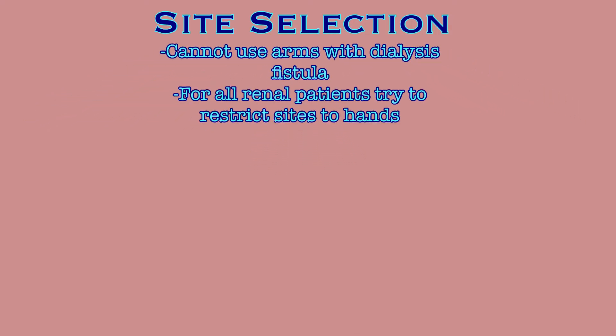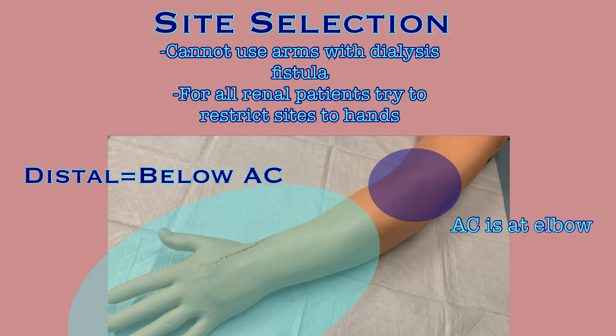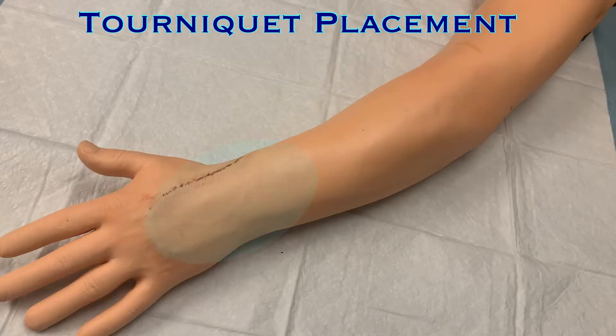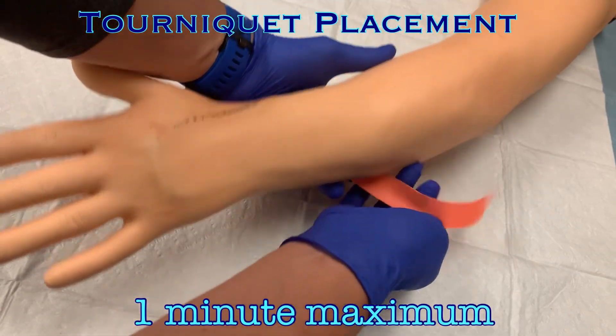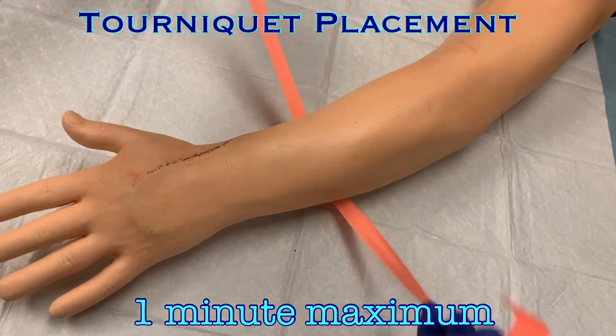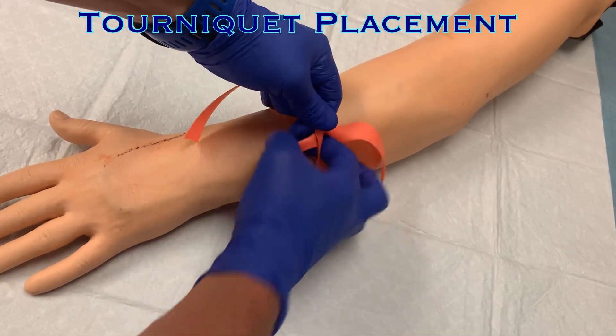If the patient is a renal patient in any respect, even if they aren't currently requiring dialysis, draw blood distal to the AC. Try to limit pokes to the hands so that the veins needed for any future dialysis access will not be damaged. With a general idea of where you want to look for a vein, place the tourniquet about 2 inches above the desired site. Tourniquets should only be on for a minute at a time at most. If you cannot locate a vein in one minute, remove the tourniquet and reapply in a new location to look again.